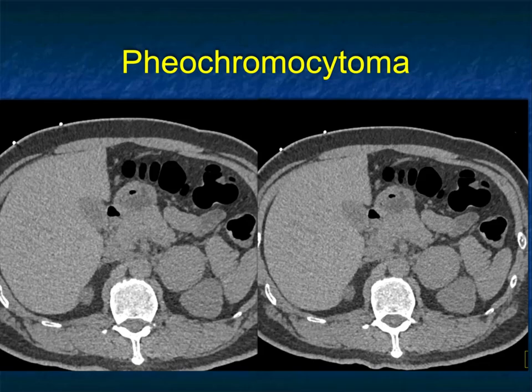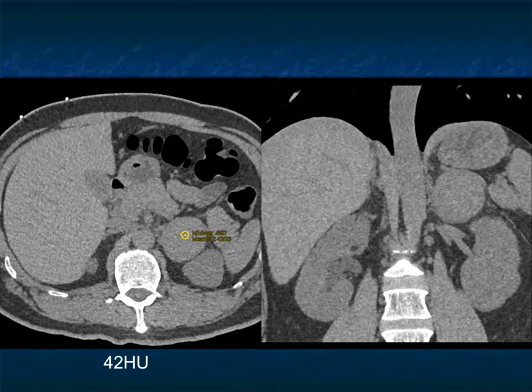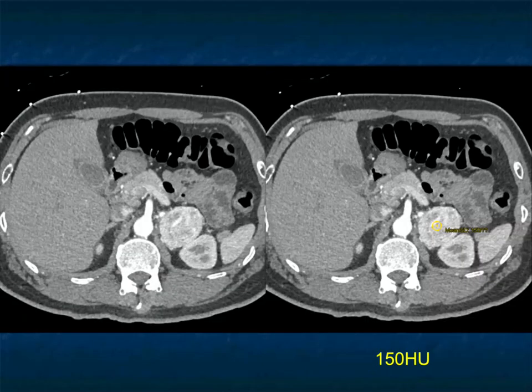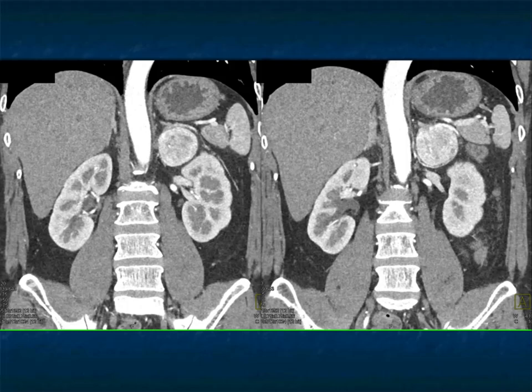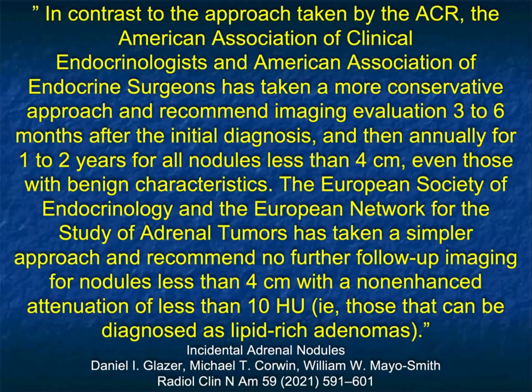Pheos are a potentially tricky tumor. Here's an incidental adrenal mass — not under 10 Hounsfield units, measuring 42, denser than the left kidney. You would do a washout value, but look how vascular it is at 150. The rule is under 120 for adenomas. Pheos will wash out very quickly, so if you go by washout value, you'll end up calling many of them adenomas. The rule is over 120 — do not use the washout value, as pheos will wash out very significantly.